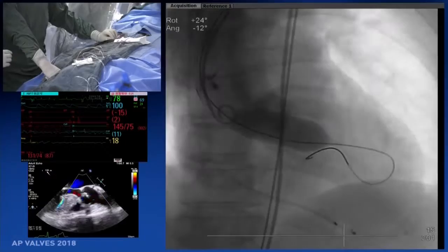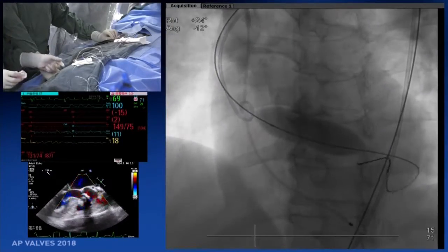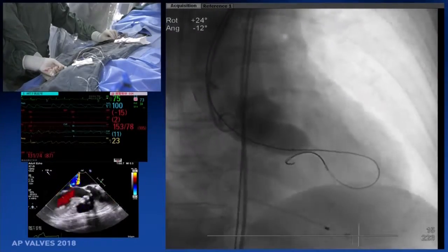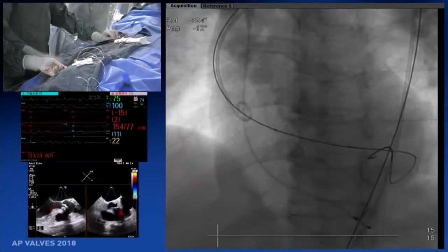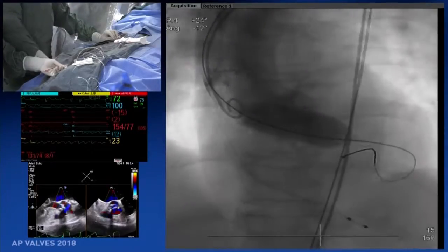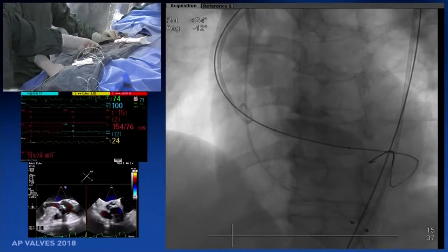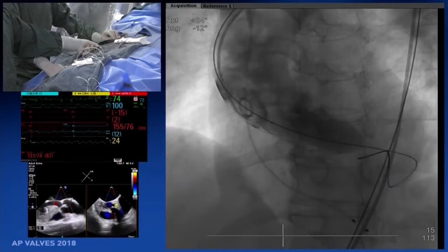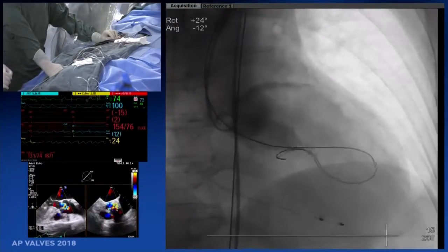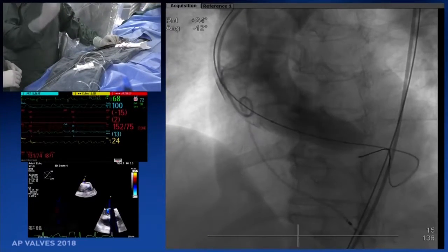Waist. This is a typical sign of bicuspid aortic valve balloon sizing. You can see quite clearly the waist on the balloon. The waist side is usually above the ring, around 10 millimeters. Simultaneously we do the angiogram, and we cannot see any leaking, no leaking. So it means the balloon 20 is enough to anchor the supraannular structure, to anchor the native leaflets.